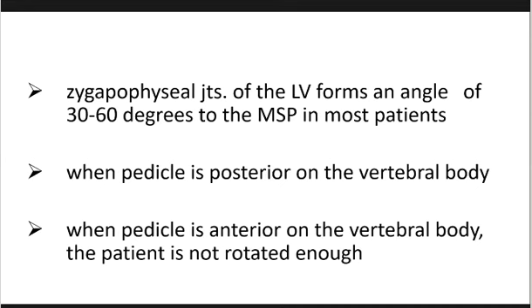Kaya normally, kung nagde-demonstrate tayo ng zygapophyseal joints in the AP oblique projection of the lumbar, the body should be rotated by 30 to 60 degrees body rotation. So I repeat, kung ang i-demonstrate natin ay zygapophyseal joints of the lumbar vertebrae, then the body should be rotated between 30 to 60 degrees body rotation.